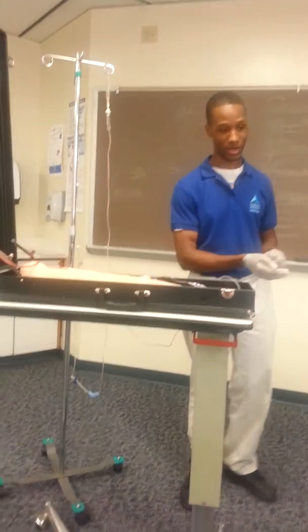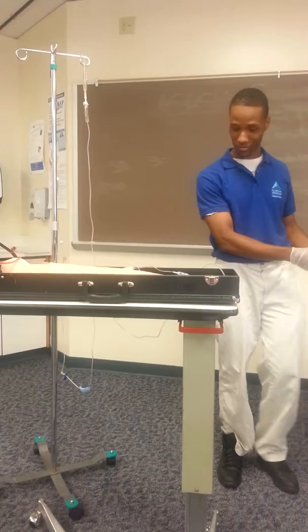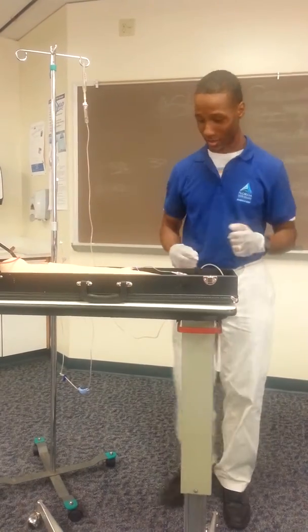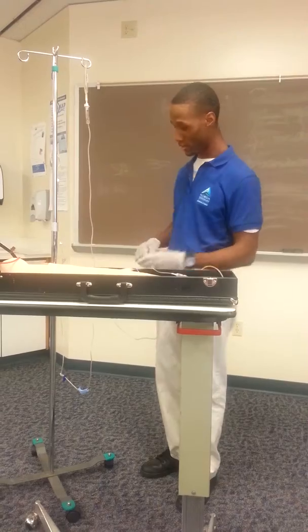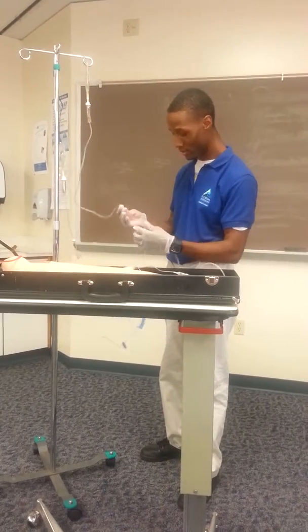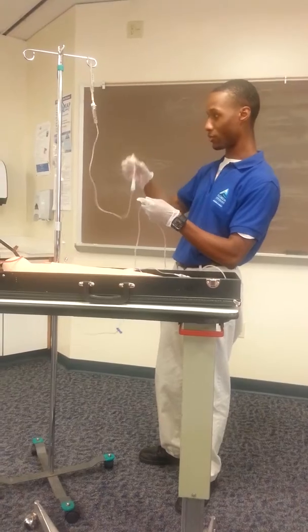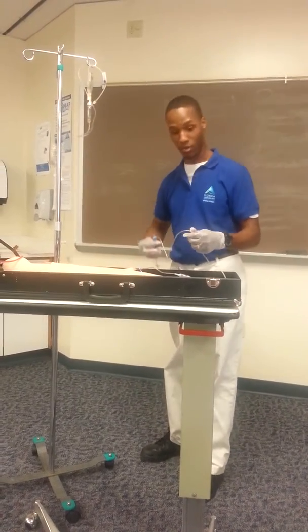I would then come back within an hour, gloves off, knock on the door, and perform hand hygiene, place gloves back on, assess the site, no bruising, swelling, discomfort. He has stated none. I would clamp off my piggyback, stop the meds. I would discontinue the medication. If needed for the alligator clamp, I would put an alligator clamp on there. And I would unclamp my primary.